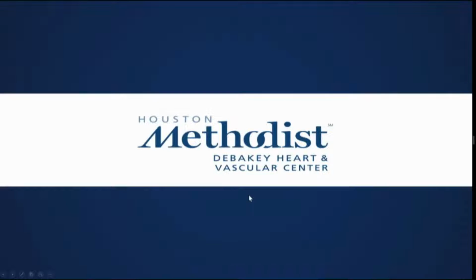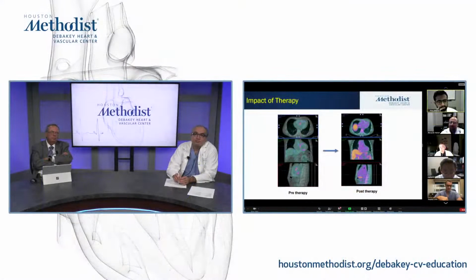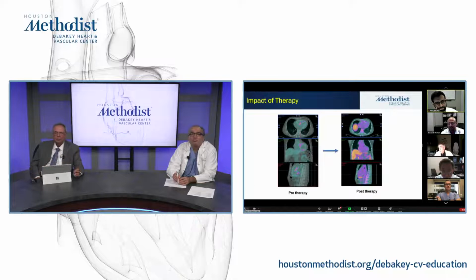If I can ask you a question, Mouaz, this is a beautiful case. John, if you want to add anything about the second case. Yeah, I think it's a beautiful example of how you can track disease activity, and we're getting more and more information on this and how important it is. And this is such a dramatic case when you look at the uptake in the left ventricle and then you just see the blood pool and nothing else. It's really a dramatic example of how the inflammatory process was aborted.